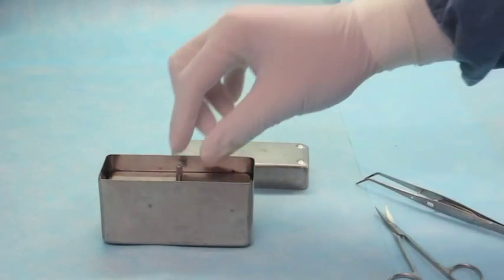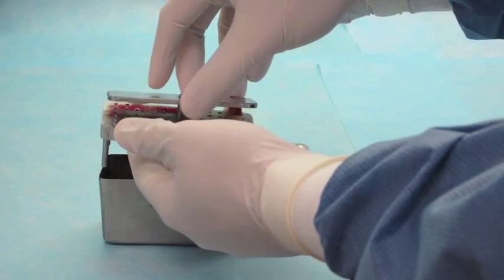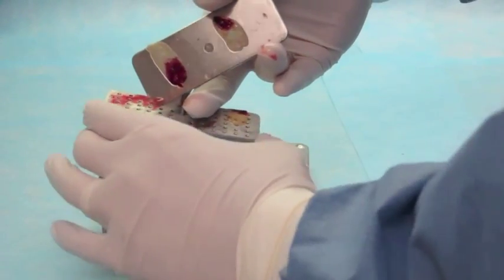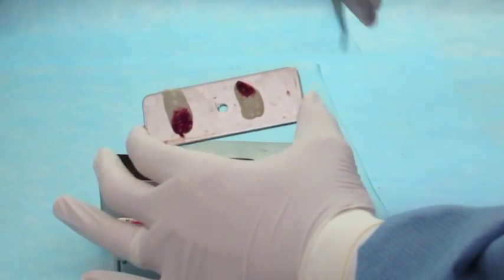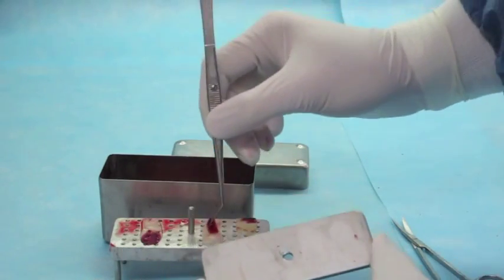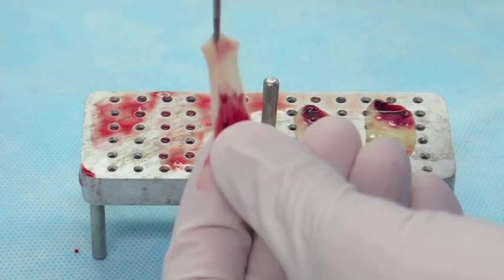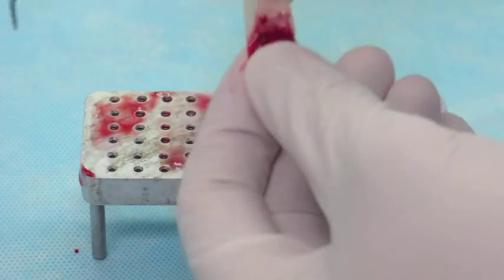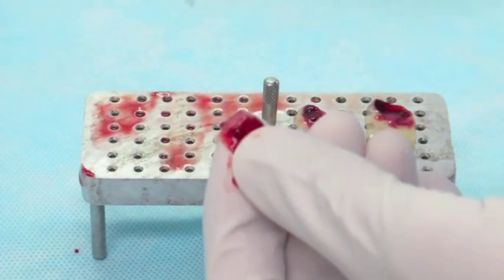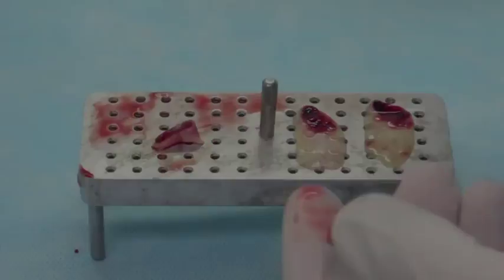After just a few minutes, it will be flattened down so you can remove the holder from the casing, release the top, and you can see the fibrin clots will sometimes be adhered to the squisher and sometimes on the holder itself. Remove those clots off the squisher if they stay on top. Then you can go directly to the mouth with them or use them however you need to. They are quite pliable — you can stretch them, suture to them, fold them, or place bone within them. They have many properties that allow you to incorporate bone and the fibrin clot into whatever procedure you're using.